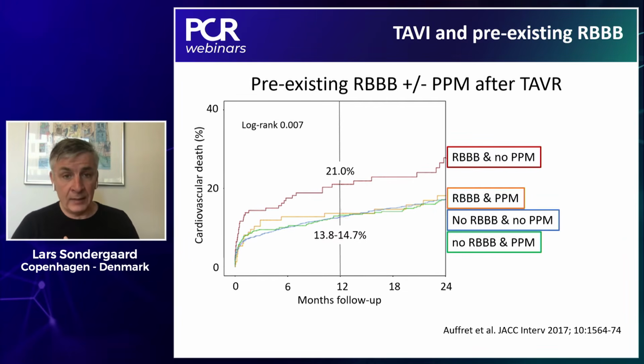I still struggle with how to handle this patient in daily clinical practice, and I still have a very low threshold for giving these patients a permanent pacemaker, just to avoid sudden cardiac death early after discharge.